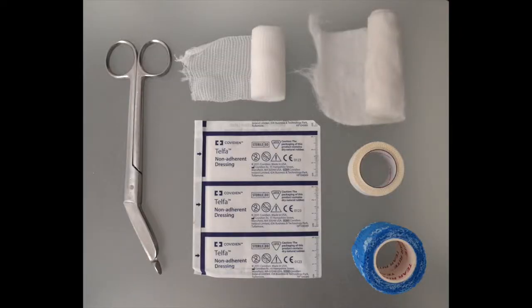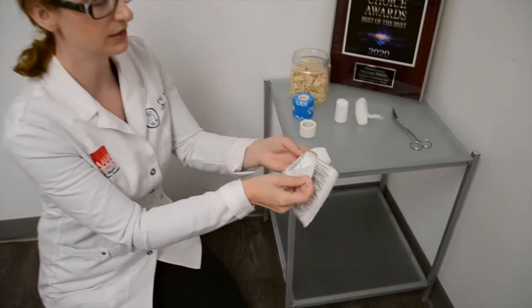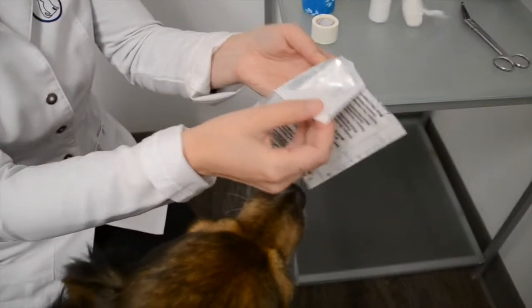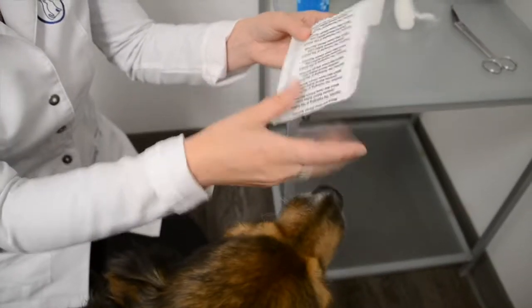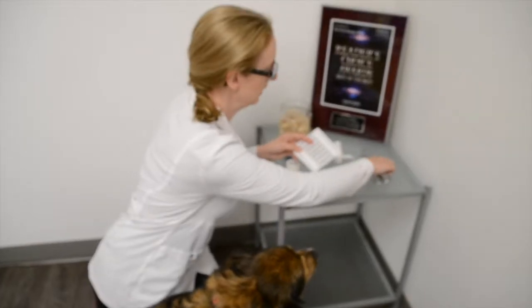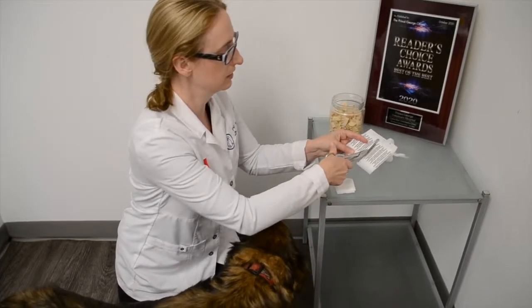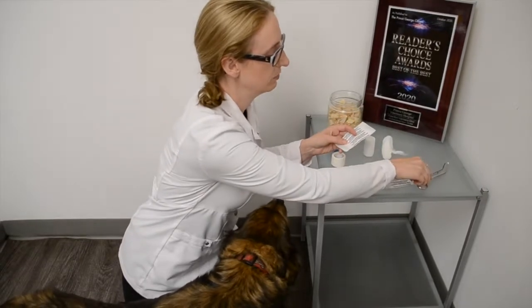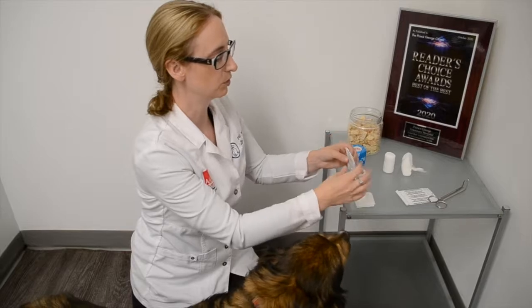One of which is a non-stick bandage. When you open them, you can see it's shiny, so those aren't going to stick to a wound. If you have a wound, these are really, really nice. These are also cuttable, so let's say you just want to fold it over the toe, you can just make a little cut, and there you go. Now you have a much more manageable size, particularly if your dog's not very big. It's nice to have those that you can cut.